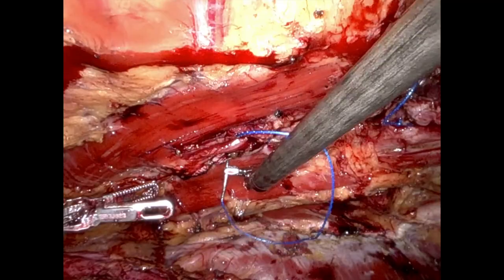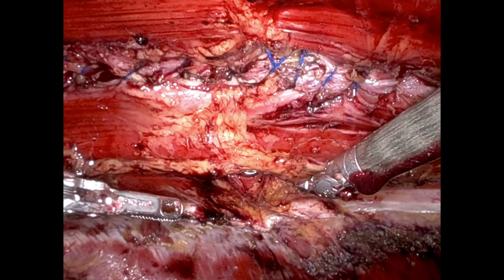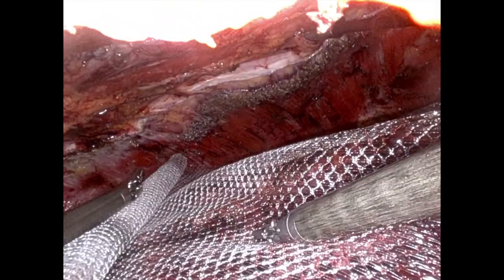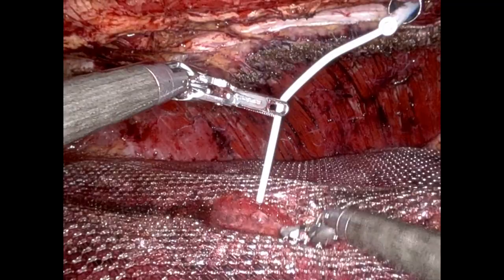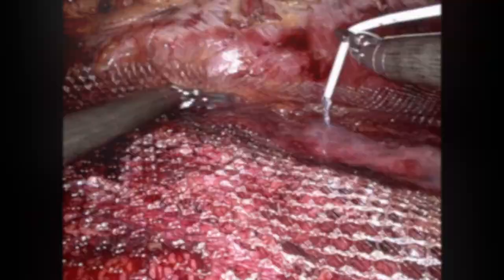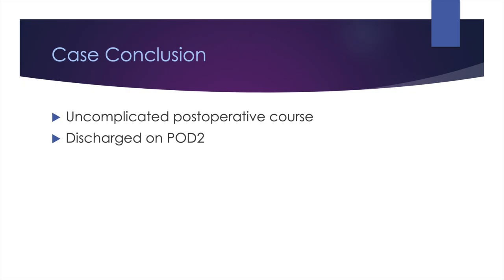After completing the midline fascial closure, we move forward with the final steps of the operation. The midline has been reconstructed and now we'll work with mesh placement. We have a 30 by 30 barred soft mesh, oriented in a diamond configuration, and we go ahead and fixate centrally with TissueSeal. I personally justify this as an approach to stabilizing the visceral sac. The patient did well but did require two nights in the hospital — overall did great and was able to be discharged home. Thank you very much; I hope that was educational.